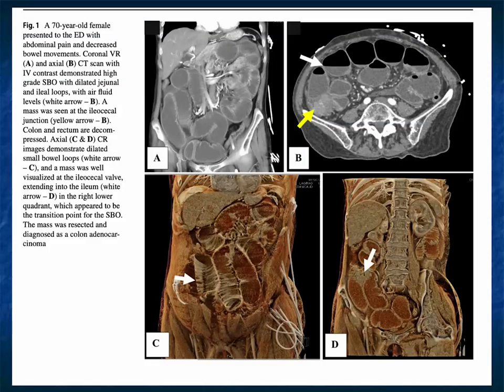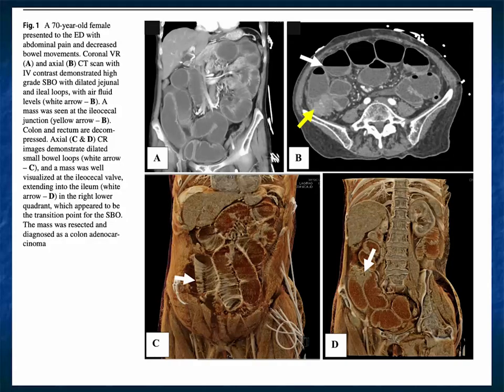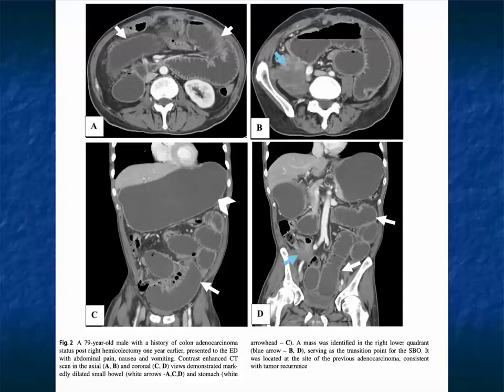Here's a nice example: a 70-year-old female presenting to the ED with abdominal pain. You can see dilated small bowel with the transition near the ileocecal region, and if you look carefully there's a mass there — this was a colon carcinoma. Sometimes the initial presentation of the oncology patient is in the ER setting. In this case it was bowel obstruction, and the transition point nicely showed us the patient's primary tumor.